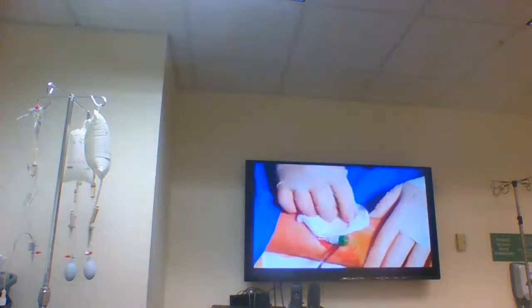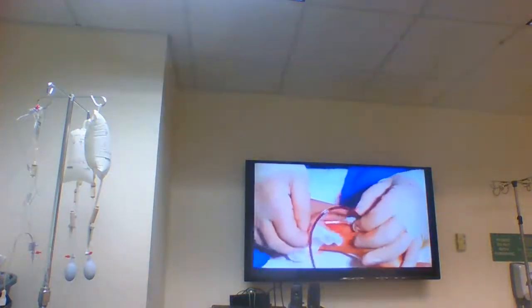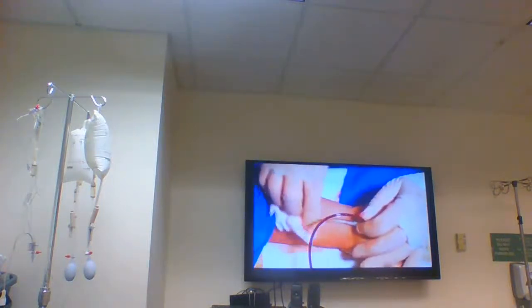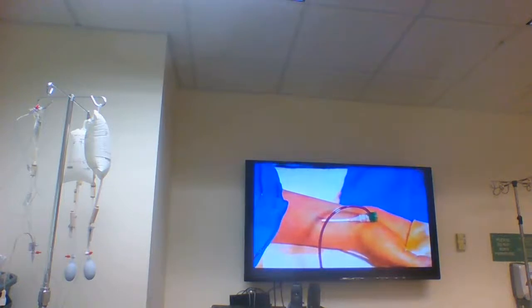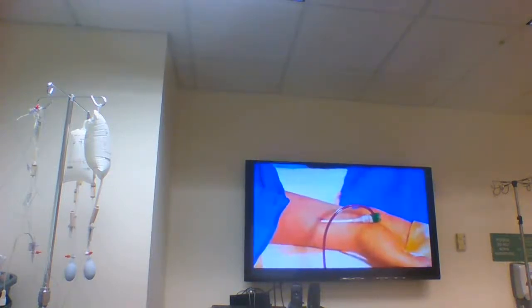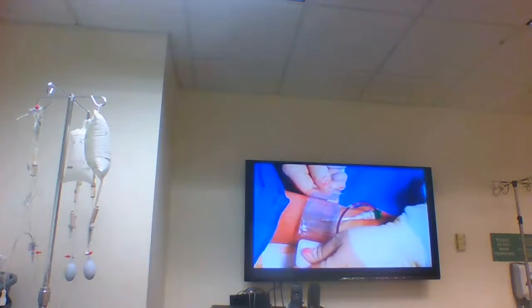After removing the dressing, we will withdraw the introducer sheath about 2 to 3 centimeters in order to properly place the band on the patient's wrist so that there is no obstruction when seating the band. The TR band must be positioned differently when used on the left or right wrist. When attaching the device, ensure that the Terumo logo on the support plate is closest to the patient's little finger or ulnar side of the wrist.